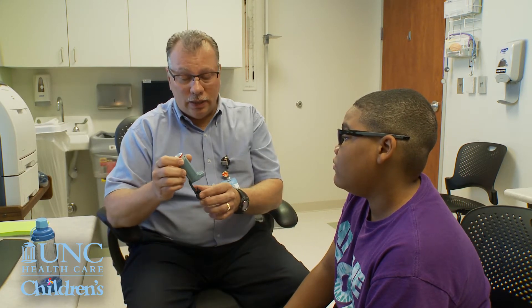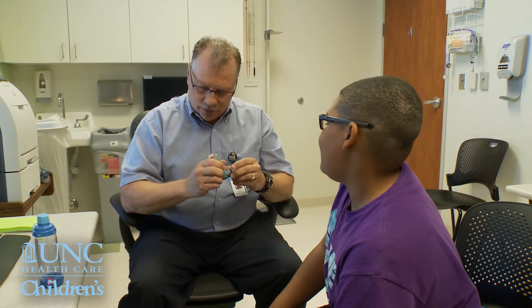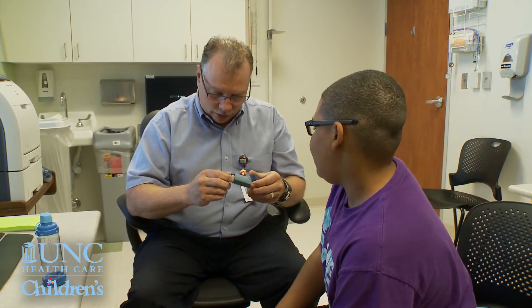For a lot of the other inhalers, it's different. You're going to get an insert in the package and I want you to open it up on the left-hand side and read that insert — they're all different. It depends on the type it is and how powerful it is, whether it's a steroid or whether it's a rescue inhaler. This is a rescue inhaler that we're going to use.